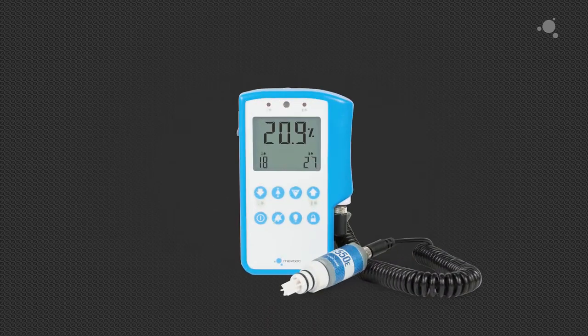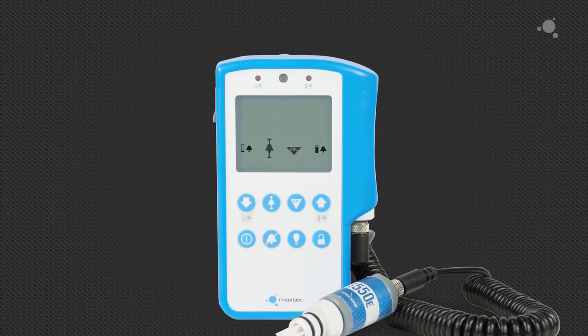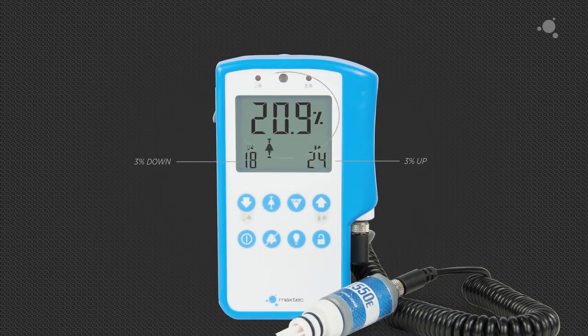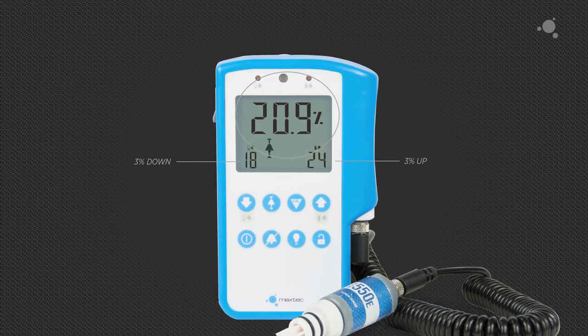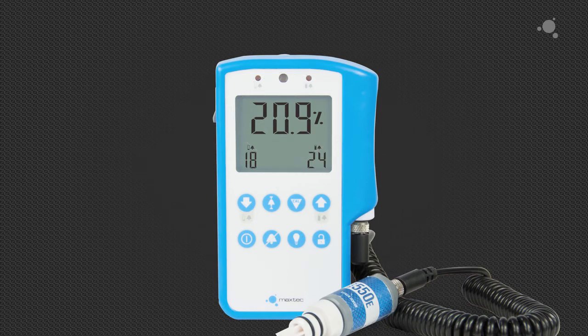The smart alarms can easily be set with the push of a couple buttons. First, press the lock button to access the menu screen. Next, press the smart alarm button. You will notice that the monitor will automatically set the alarm guardrails 3% down and 3% up from the current reading on the monitor screen. Pressing the lock button again will set the alarms.